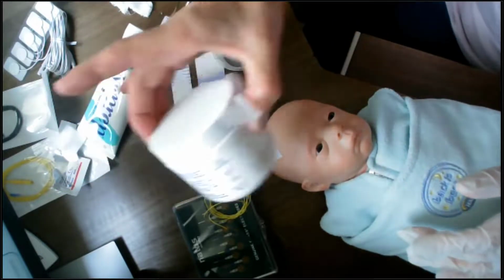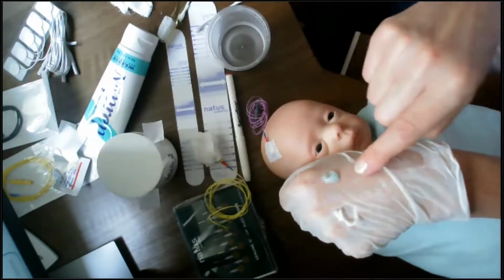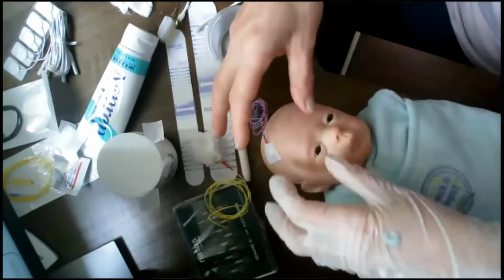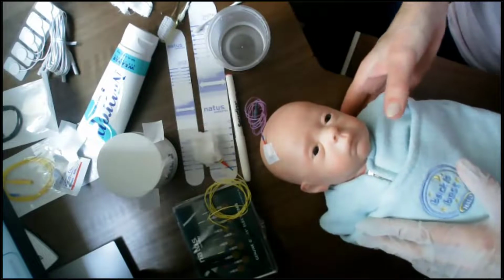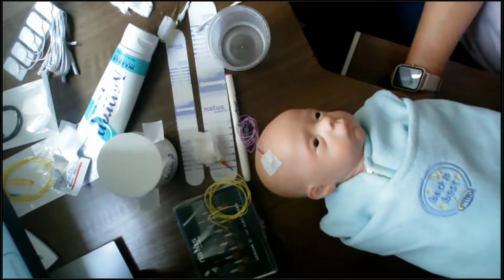So the extra step with gold cups is the use of the 10-20 paste. My way of doing it, it's not everybody's way, but I like to have it on the back of my hand. I just find it easier to have everything with me when I'm actually in and preparing electrodes inside the incubator. Okay, so what I'm going to do now is stop sharing my webcam for a minute, and share with you guys a video that is going to run through each of these steps one by one. So this is just 2 minutes of video.